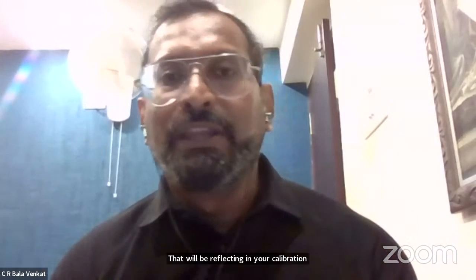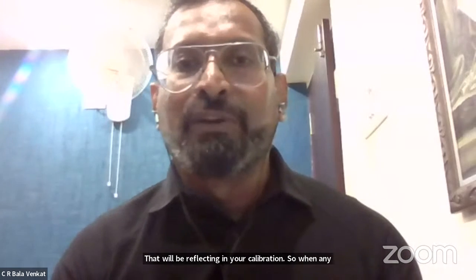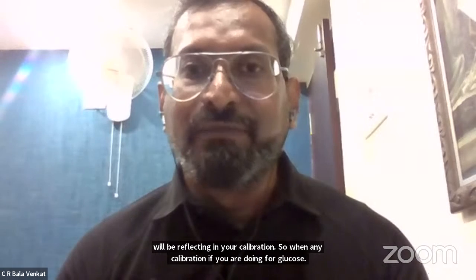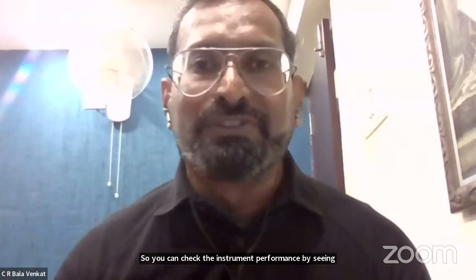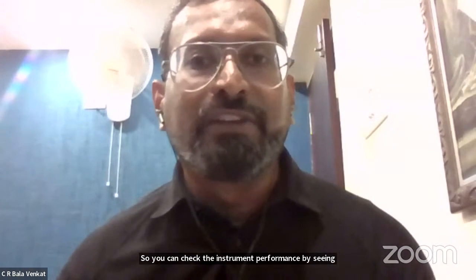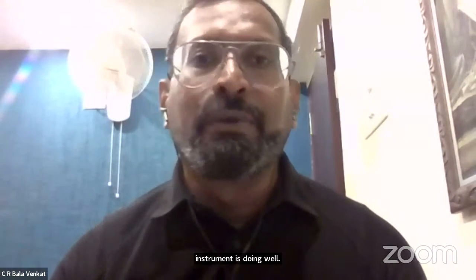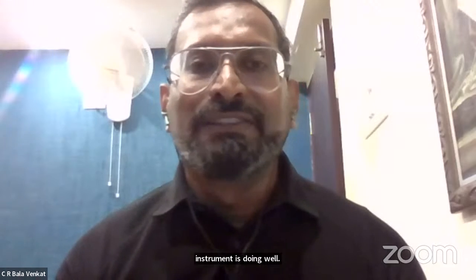So when you are doing any calibration, for glucose, you can check the instrument performance by seeing when you are doing your next glucose calibration. If you are doing it after 1 month, that means your instrument is doing well. No need to change, because every day your control is on the same target. So that way you can do.